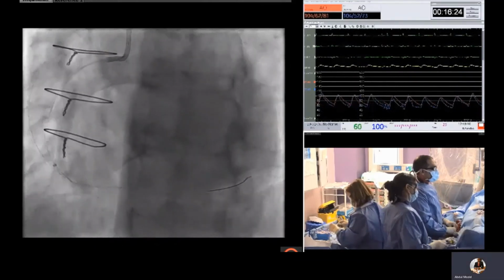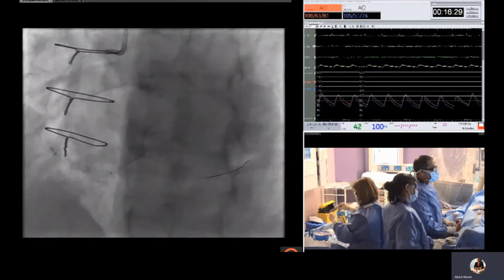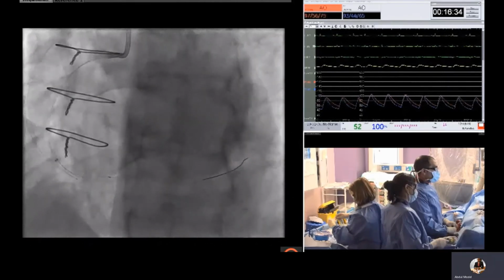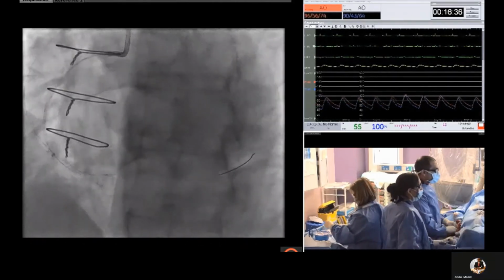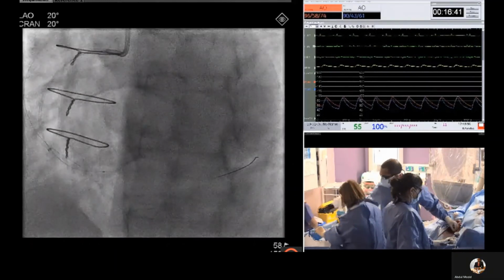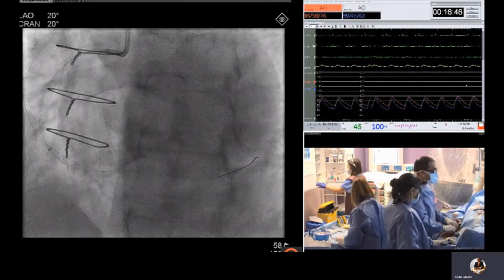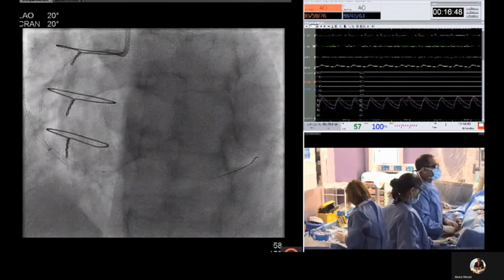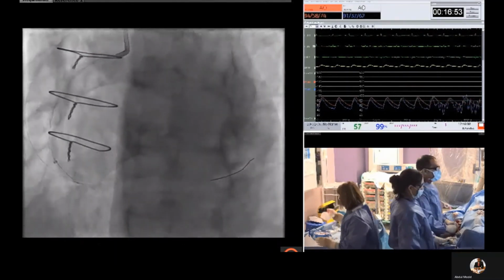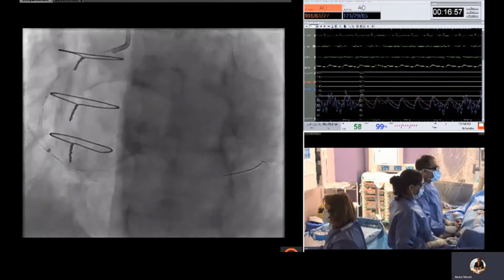And this, I think, gives some indication of the unique properties of the Mamba catheters, enabling them to cross calcified lesions where other devices are not able to. So we tried a variety of balloons with no success. And here again, you can see pushing on. Absolutely no luck.